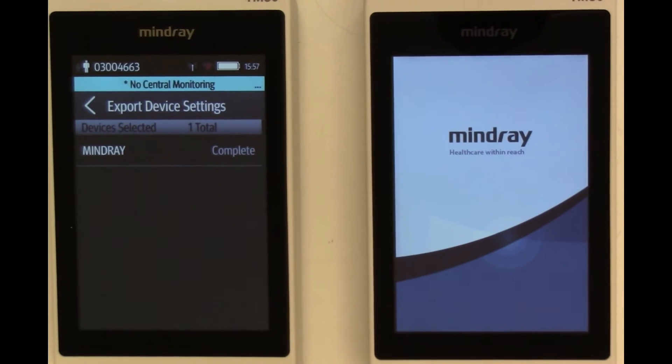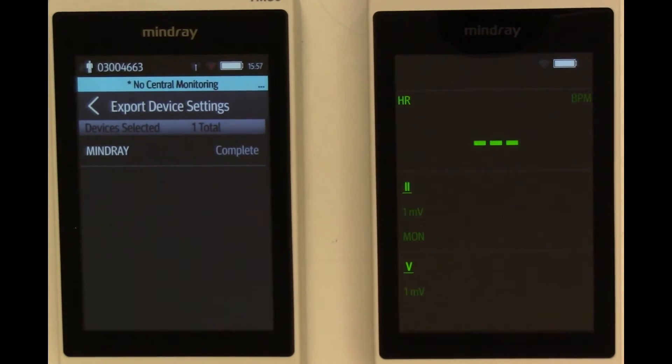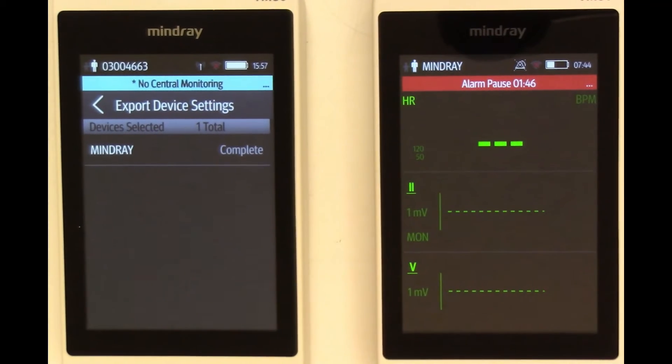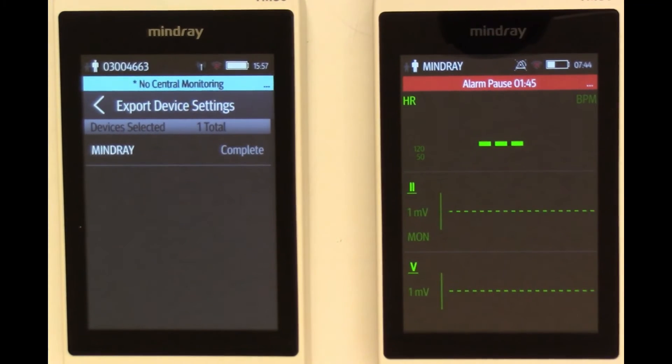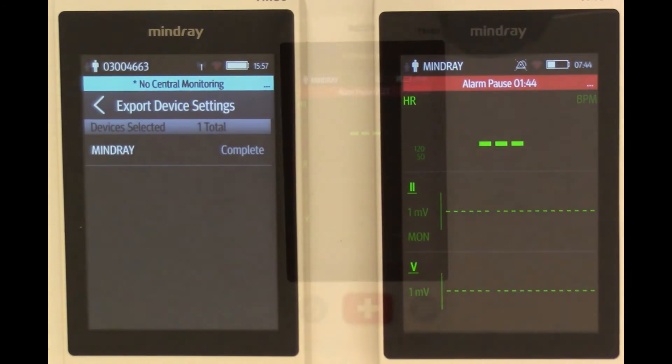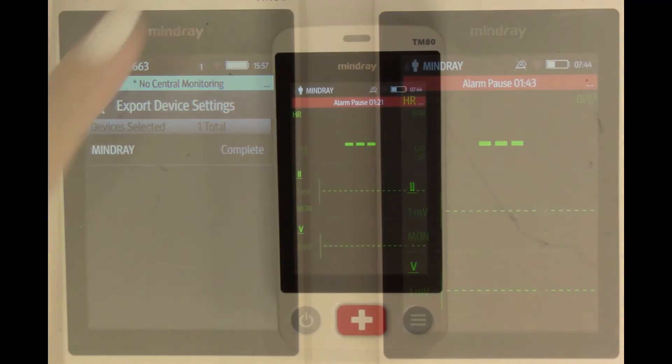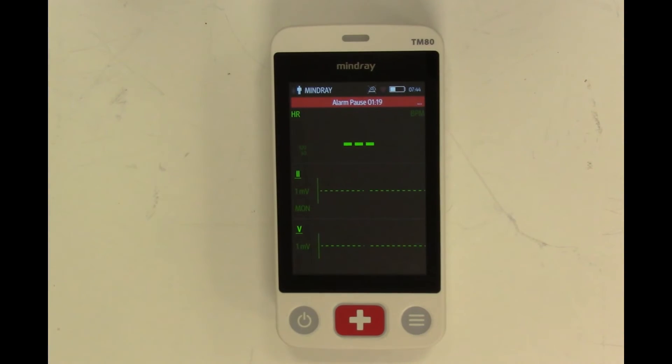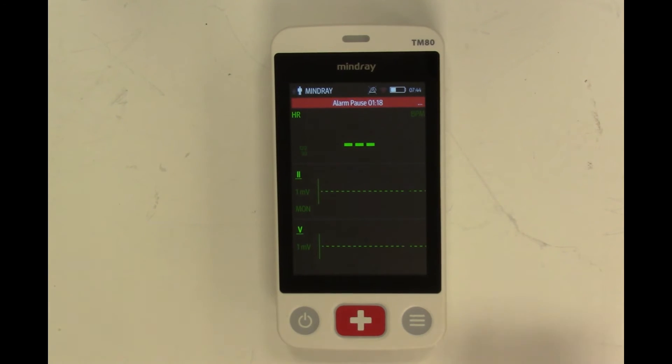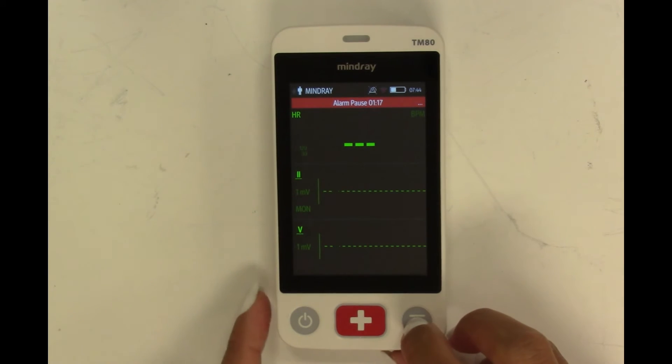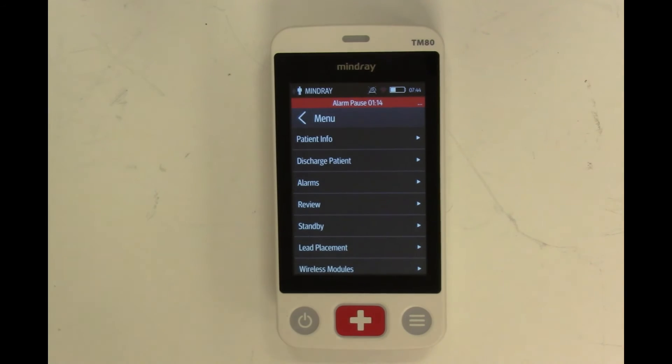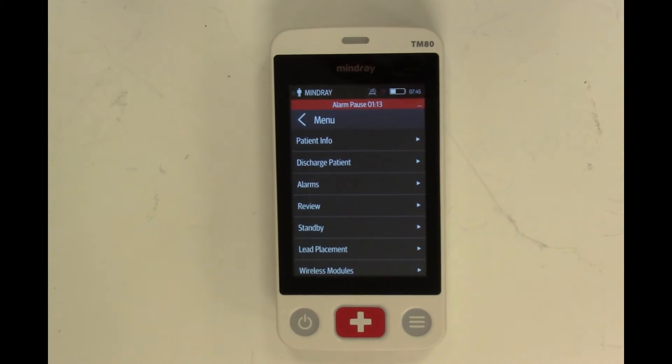You may remove TM80A since it now served its purpose delivering its configuration into TM80B. The only settings that need to be configured manually after the cloning is the IP address setup under Network Setup. Select Main Menu.